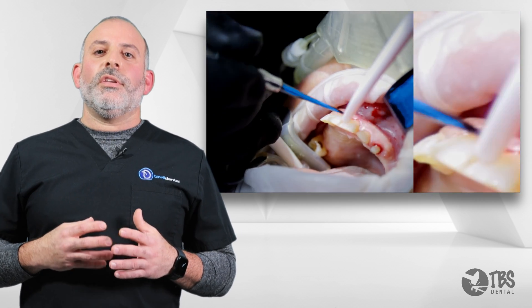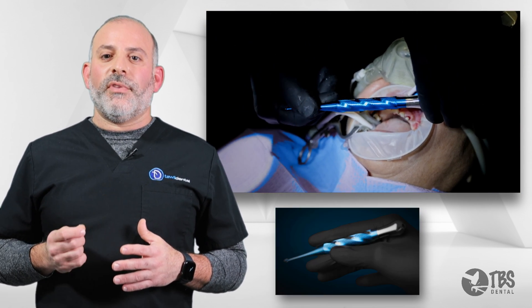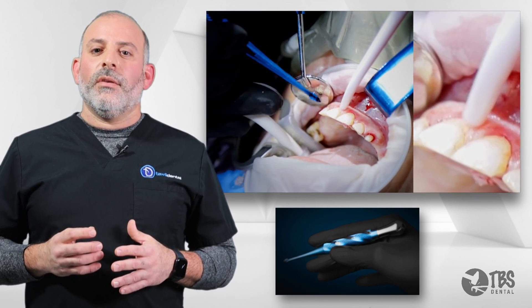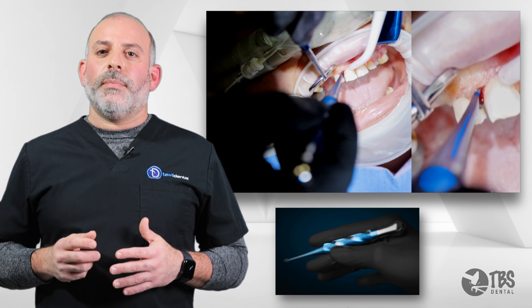The next step is to use the Elvatome 2.0. Starting in a pencil-grip fashion, we can find a purchase point along the root itself. Once we find this purchase point, we can convert over into the palm grip.